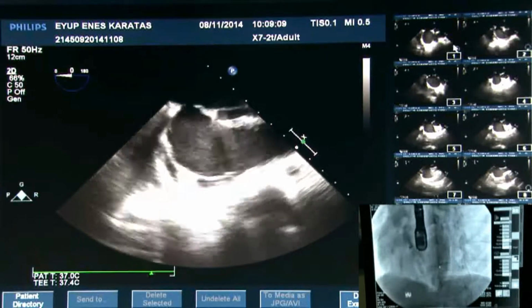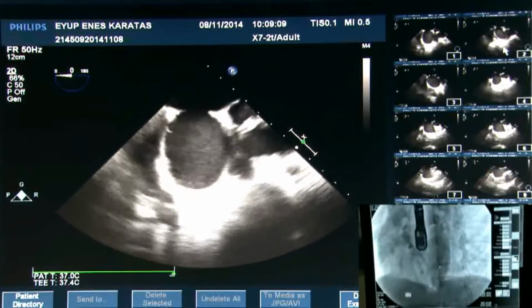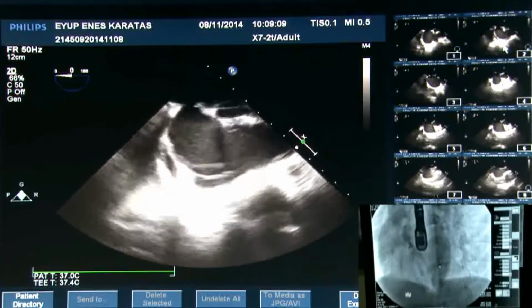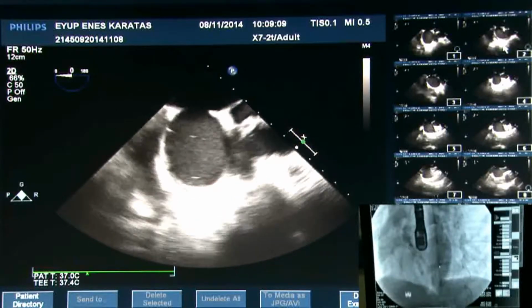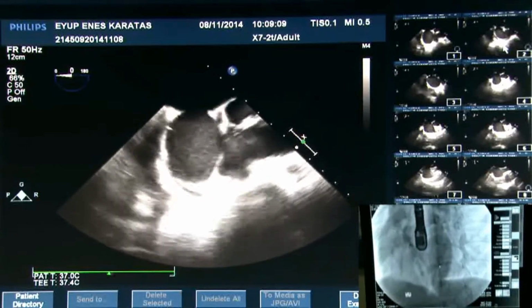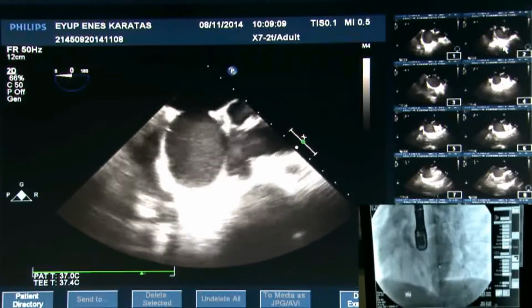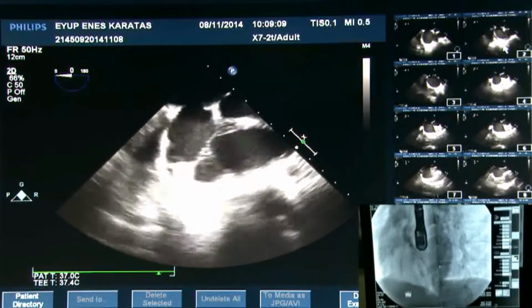Yeah, that's just true, before doing anything. Exactly. I think this is an important observation. You have to know that this fluid is present at the beginning, and not to be worried in an inappropriate way if you see this tiny fluid during follow-up, because it can be misleading towards the question of erosion or tamponade. Yes, that's true. That's a very good point.